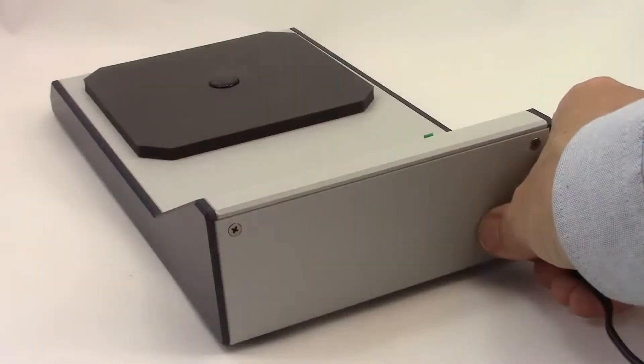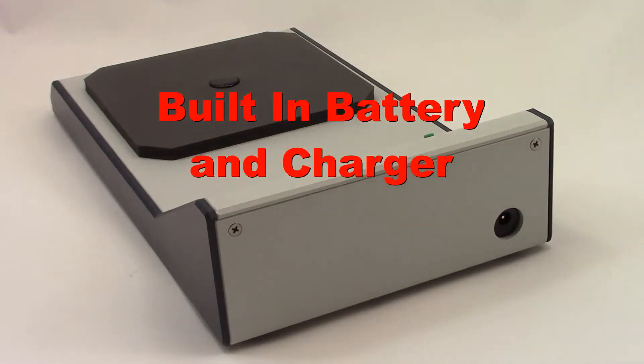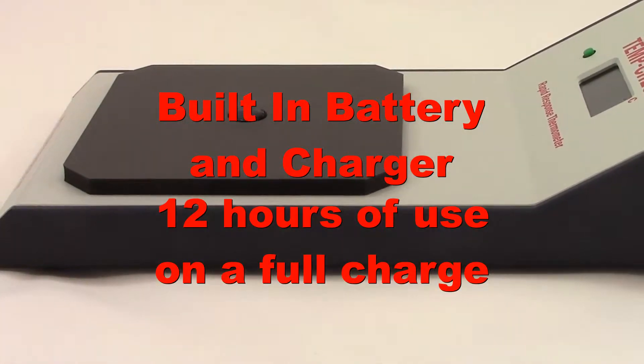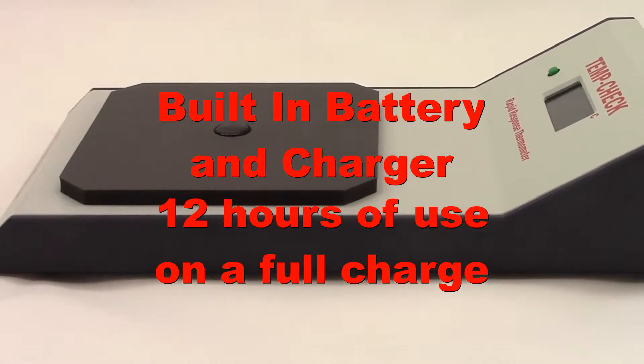For easy portability, the TempCheck includes a built-in nickel-metal hydride battery and trickle charger. When the battery is fully charged, it will run for approximately 12 hours.